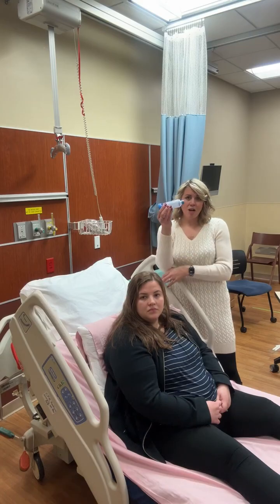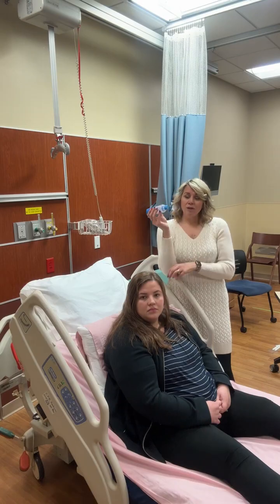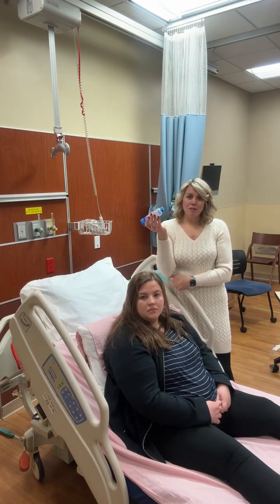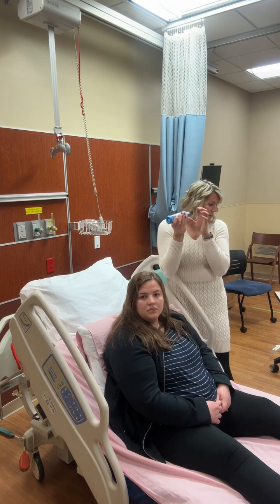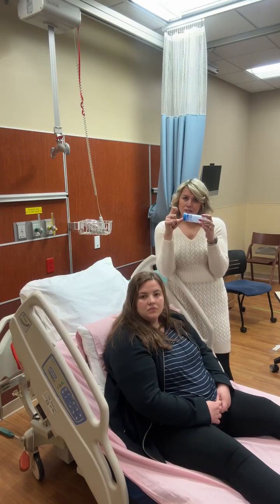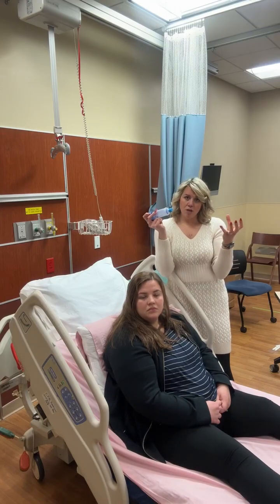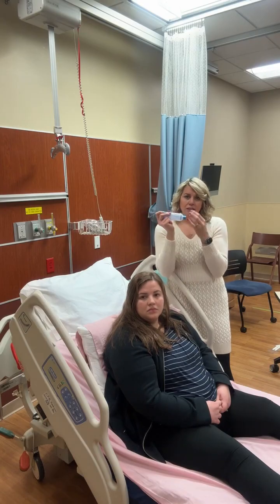You'll also see that these come in different colors, and sometimes you'll see a mask on the end of it, and we actually use that for babies and children. So when we put it on their face, they can't do a coordinated breath hold either. It looks like a mask that we put on an ambu bag or something like that. We will push the canister down, and as soon as the baby breathes, the medication will come out just like it did when Ashley did it. It'll come through the one-way valve. The baby will eventually have to breathe in through the mask.